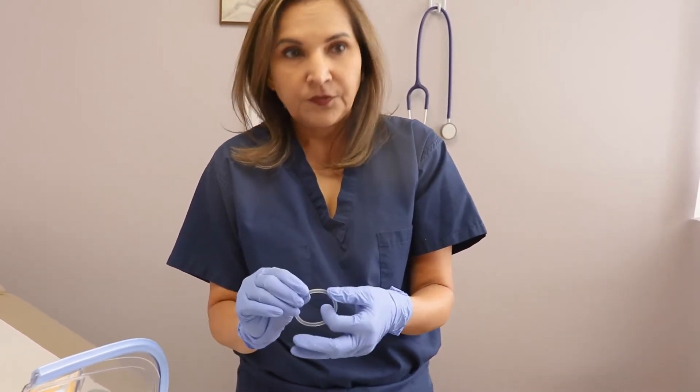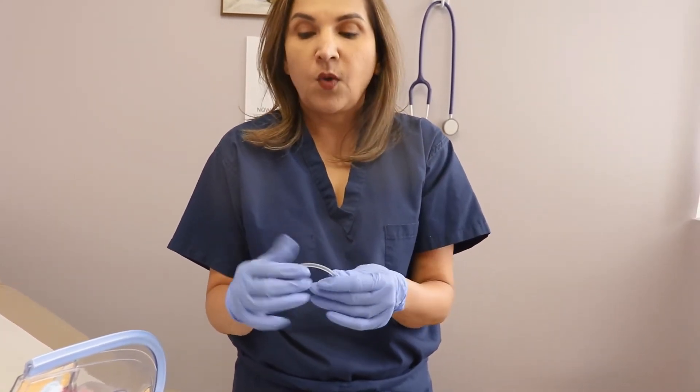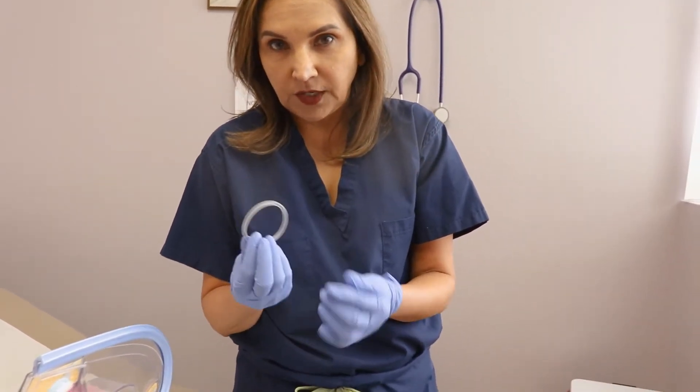There's absolutely no reason to take this ring out. But if you do for whatever reason, make sure the ring is back inside within two hours. Just rinse it with warm water — don't use hot water, because hot water will release the hormone. If you're having difficulty putting the ring in, you can use a little coconut oil or a water-soluble lubricant like KY and just push it in.